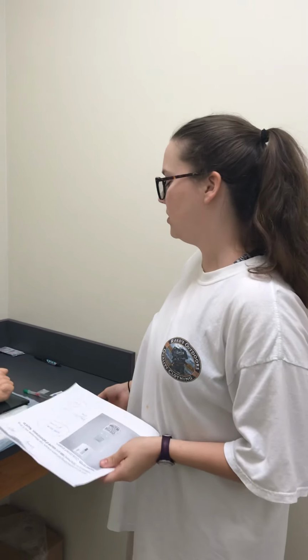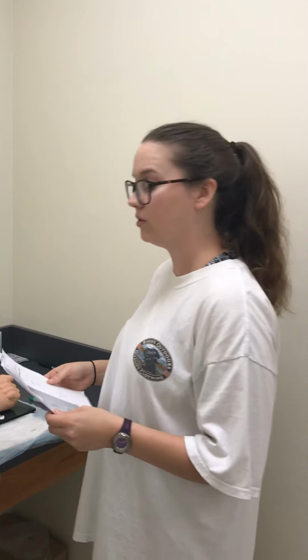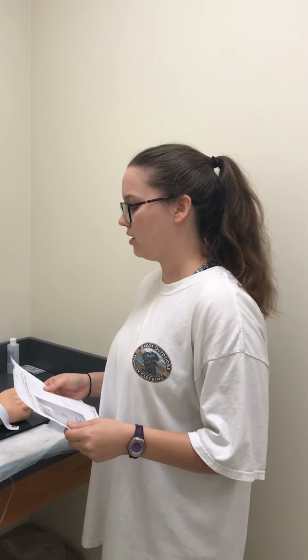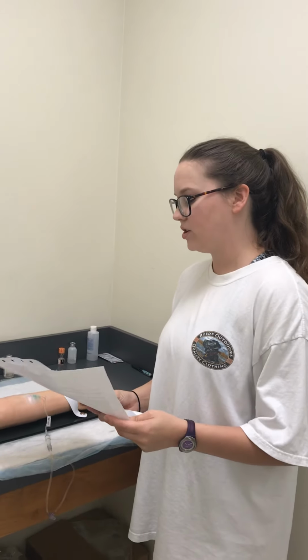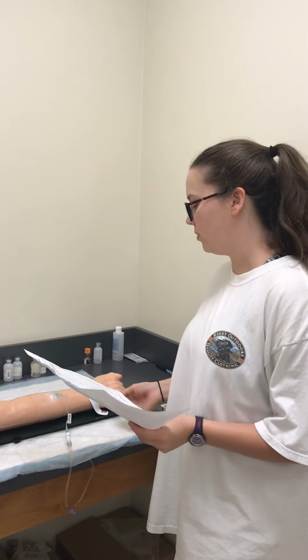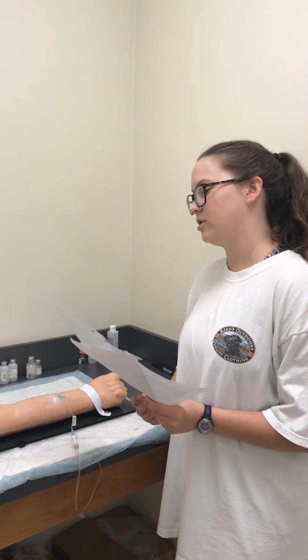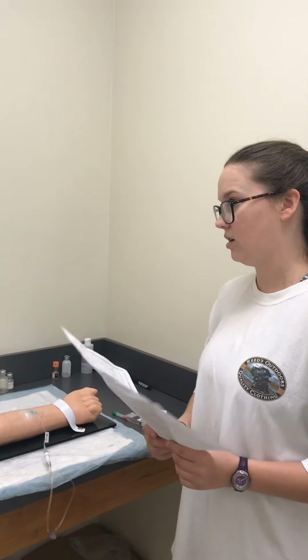Hello, my name is Kennedy. I'm gonna be your RN today. I'm going to be delivering an IV push of Solu-Medrol. That's an anti-inflammatory. Your doctor has ordered 10 milligrams, and I'm going to go ahead and check with my MAR. Ask my patient to tell me his name and date of birth, which is correct. I'm going to ask the patient to verbally tell me if he has any allergies, which he does not.